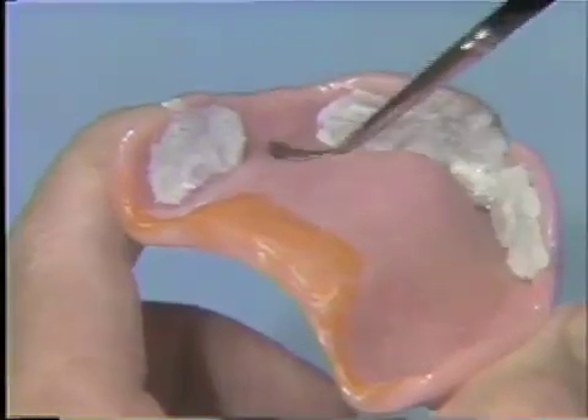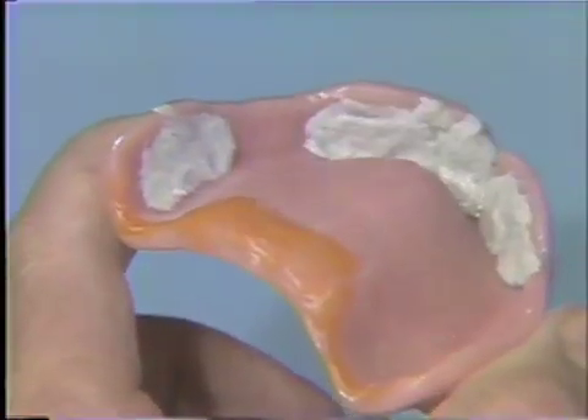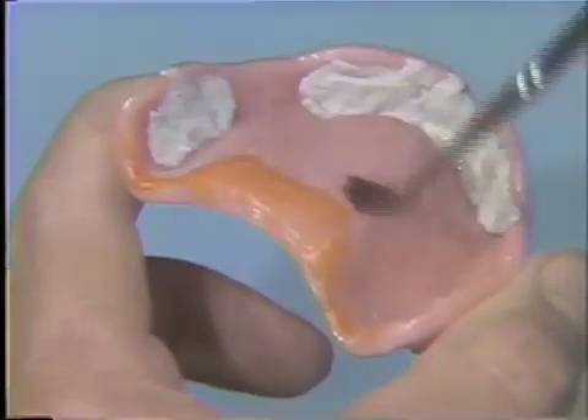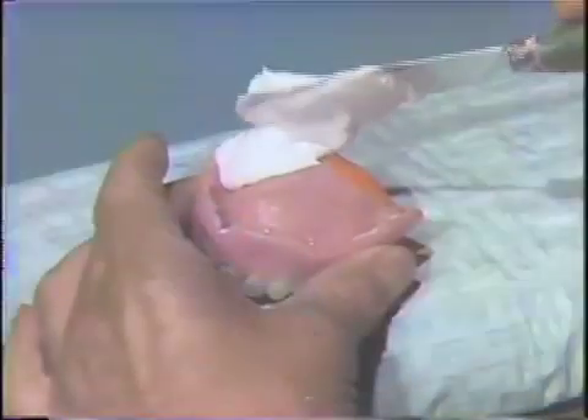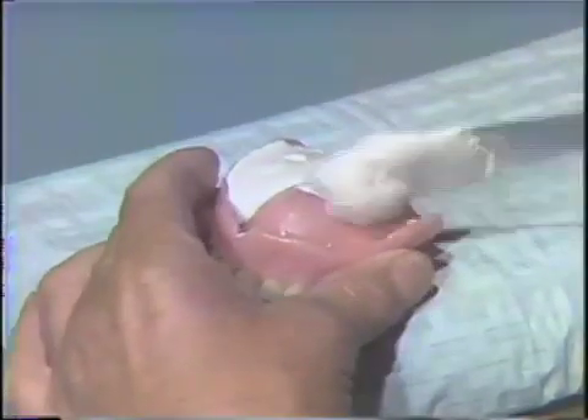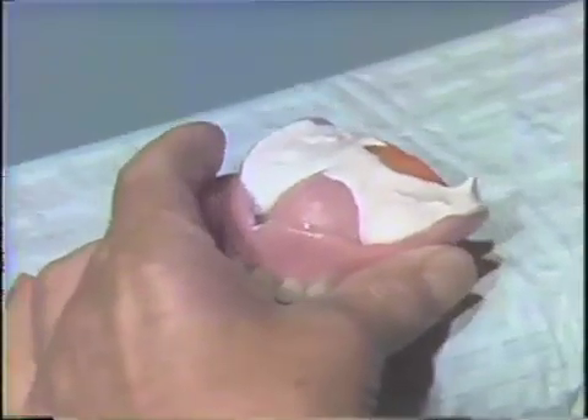Lubricate the entire internal surface of the denture with tinfoil substitute. Mix a small amount of impression plaster and vibrate it into the residual ridge area of the posterior palatal seal.